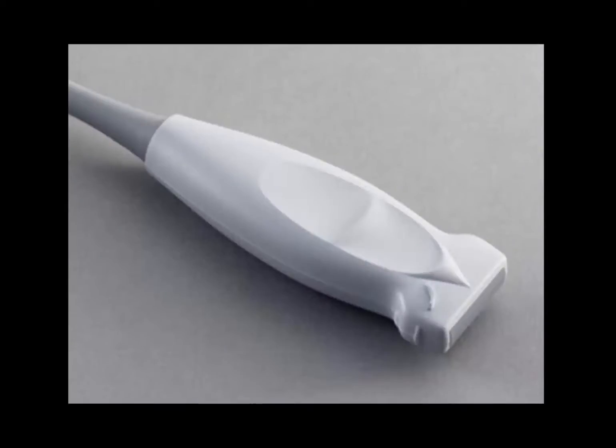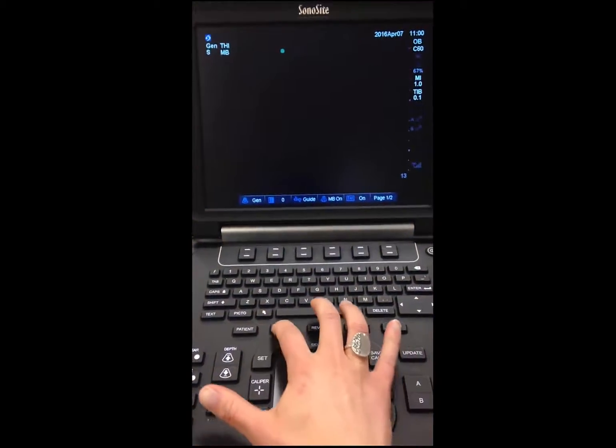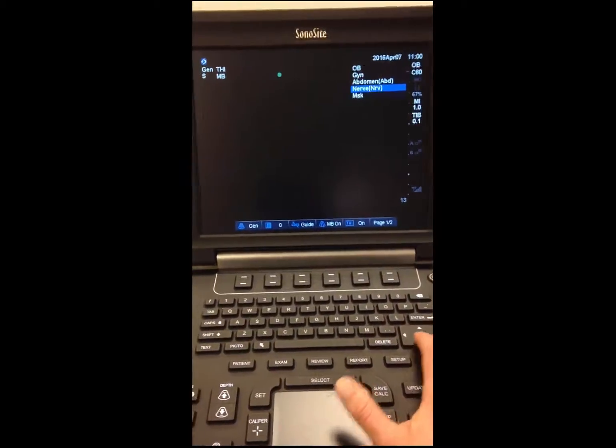You will also need the high-frequency probe set to the nerve setting. To set it up, hit the exam button on our machine, scroll down to the nerve setting, and hit SELECT.